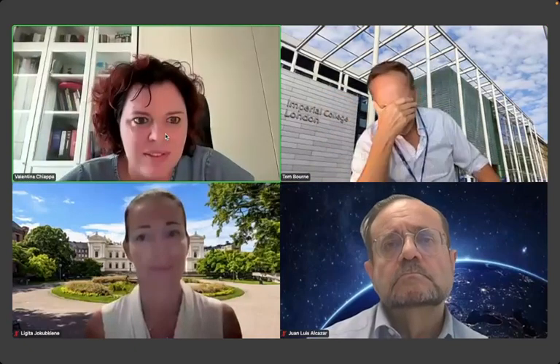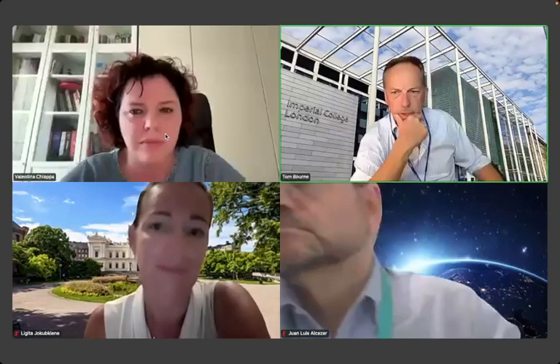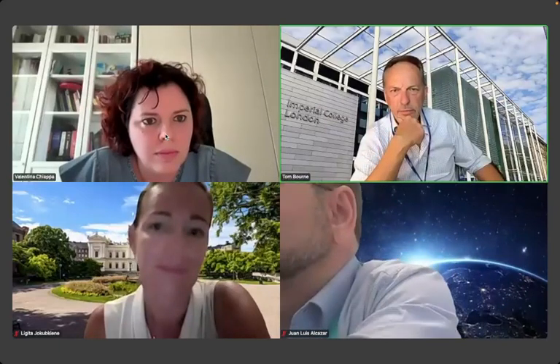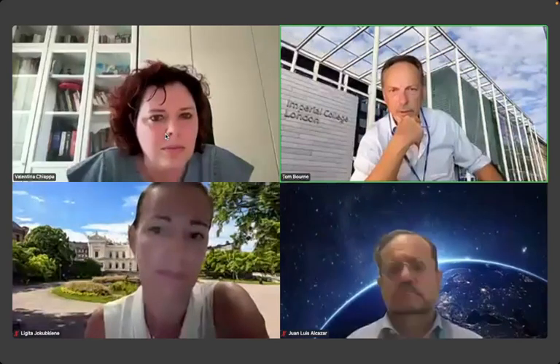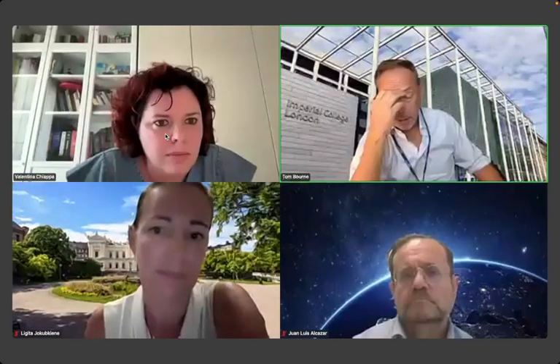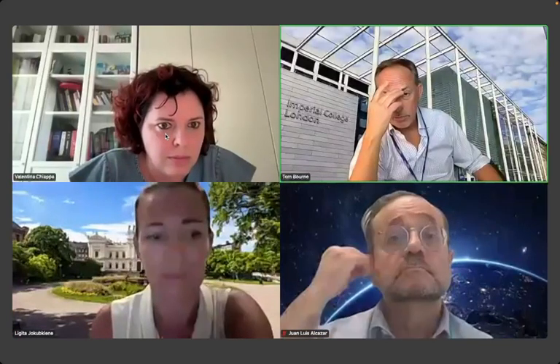But anyway, I think Gita, certainly in Malmo, in Lund, you looked at vascular pattern, didn't you? I think, was that you? And I suppose one might argue that MV flow may allow more details of vascular patterns. Perhaps, I don't know any data on that, but is that somewhere where you feel, am I picking you out unfairly, Gita? But I certainly know that I think you published on that, haven't you?